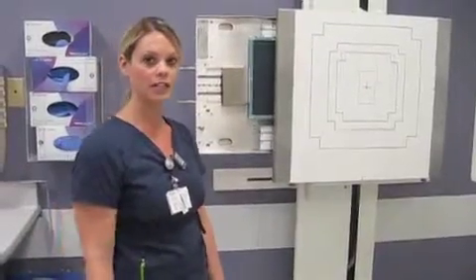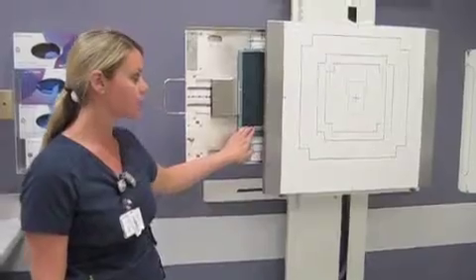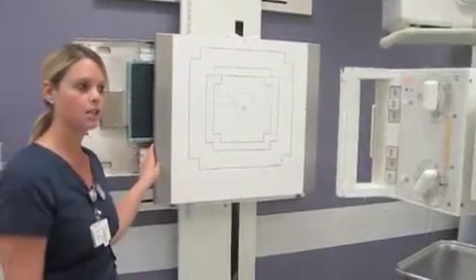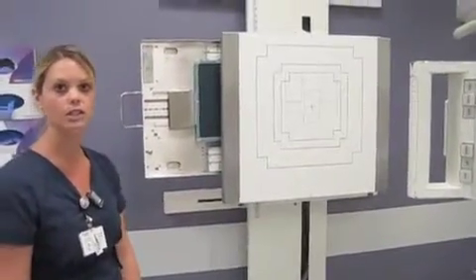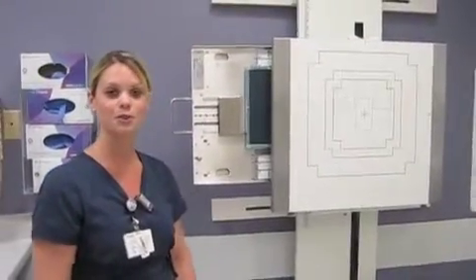Okay, so for all of our sinus and mandible images, we take it on the 8x10 film. Our tube and bucky are aligned and detented. The tube is at 40 to 48 inches for all these images. And make sure to collimate to the parts and also to shield the patient. Okay, so now I'm going to start a mandible series. I'm going to go get my patient.